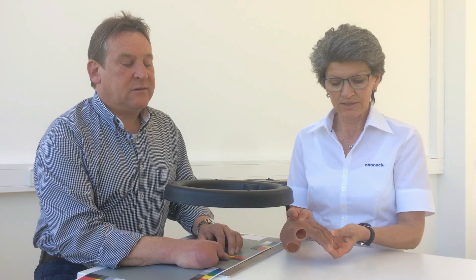I'll demonstrate step by step how to determine colors for a classic partial hand prosthesis. We will be identifying three skin tones, but first we need to make a few preparations.